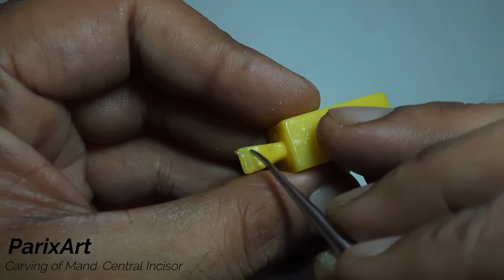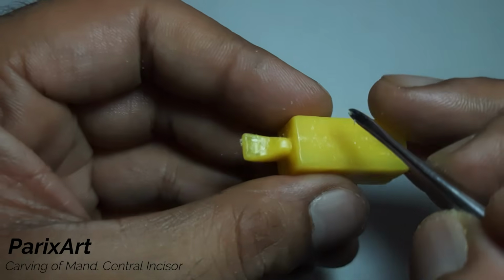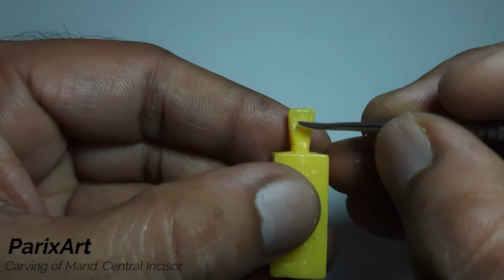As you carve, you'll slightly develop raised marginal ridges on both sides. Also, you'll develop a raised area in the middle too.